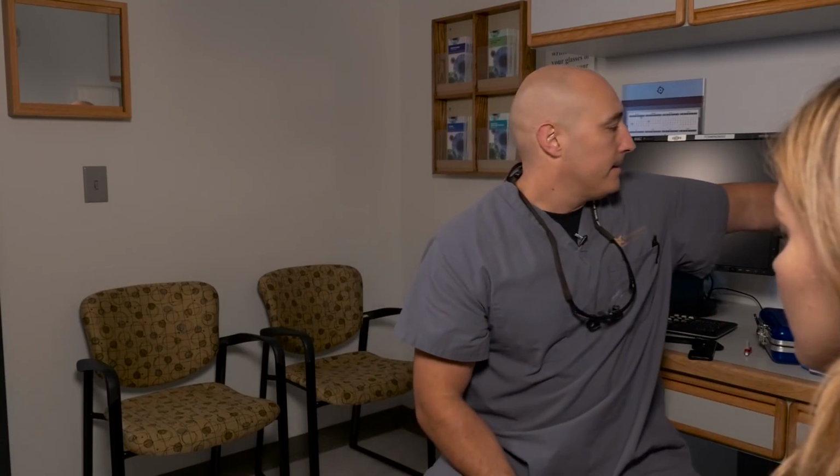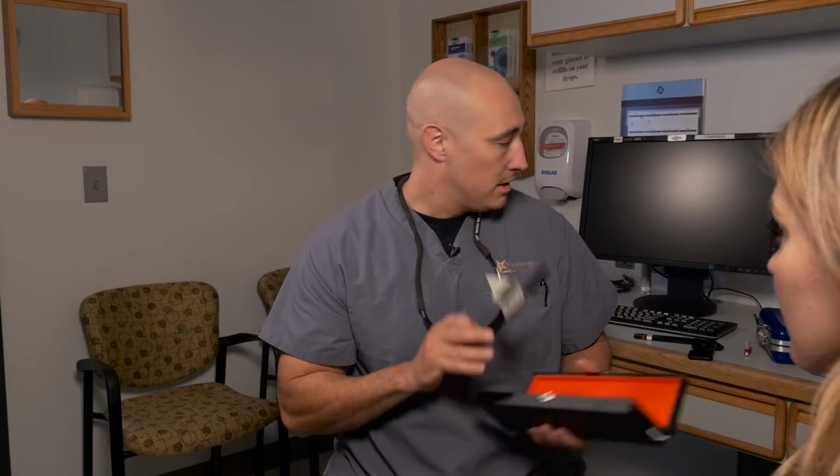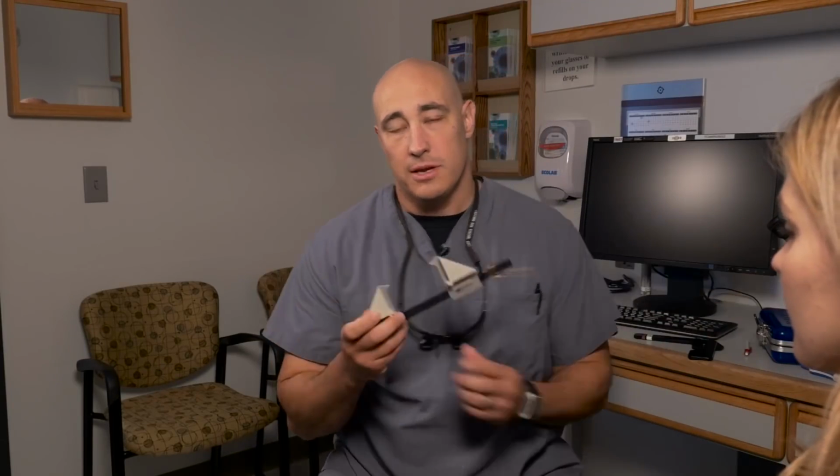All right, so moving on with the orbital exam, I want to check your eyes to see if one eye is farther forward than the other, okay? So we're going to use an exophthalmometer so that we can measure for relative proptosis or enophthalmos, okay? This works very well if a patient has normal bony structure.